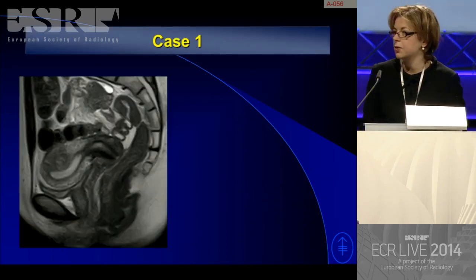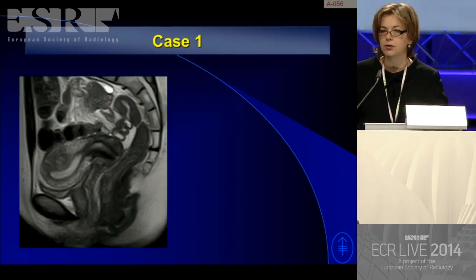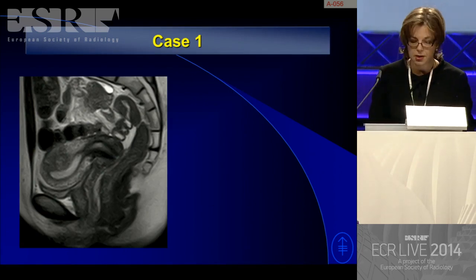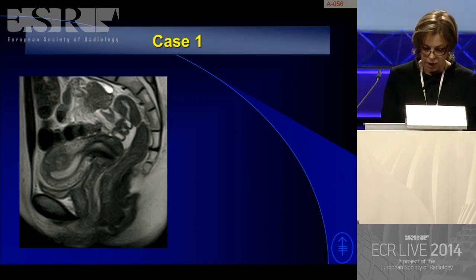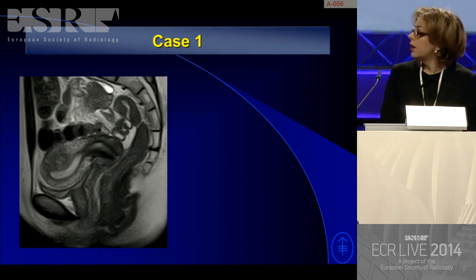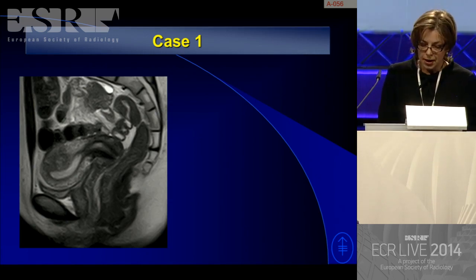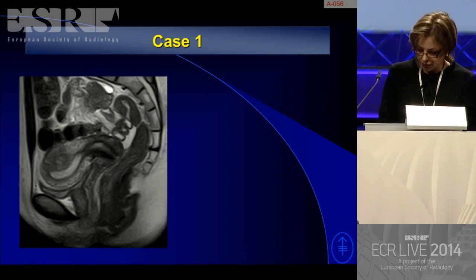Let's start with case one. A sagittal MRI of the pelvis on a female patient.